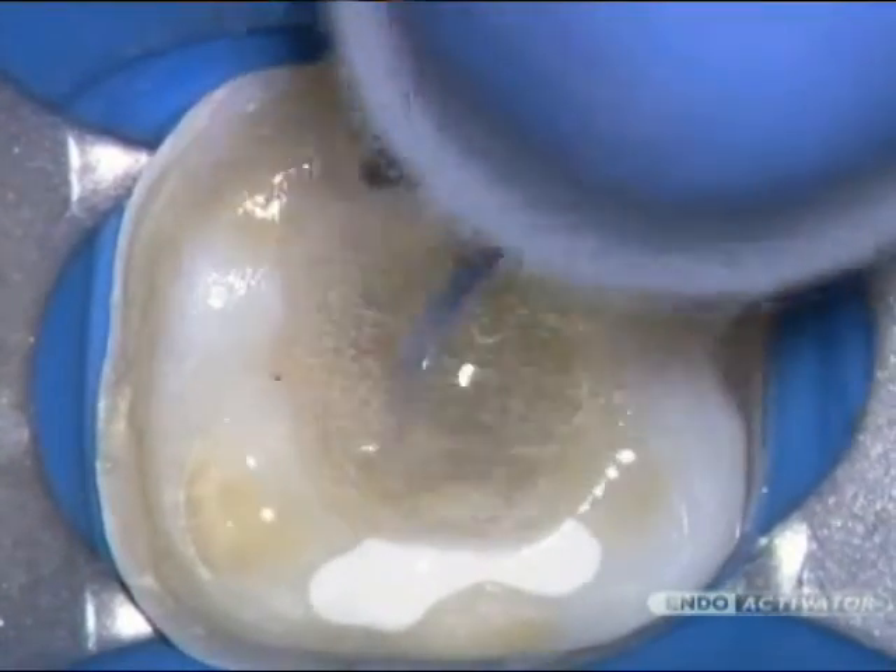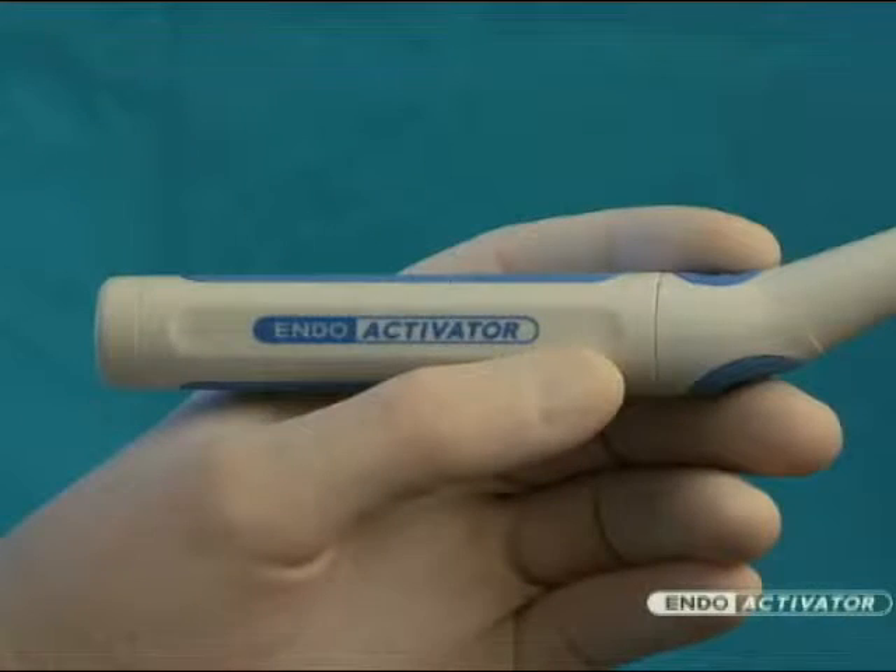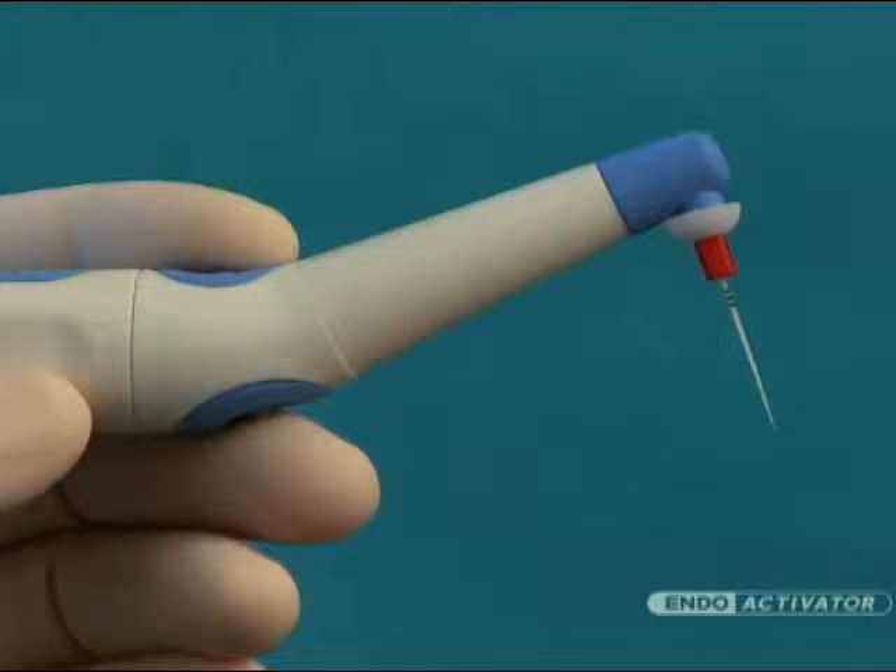Let's take a closer look at this new, innovative, and easy-to-use technology. The EndoActivator system is comprised of a cordless, contra-angled, and ergonomic handpiece that drives the EndoActivator tips.